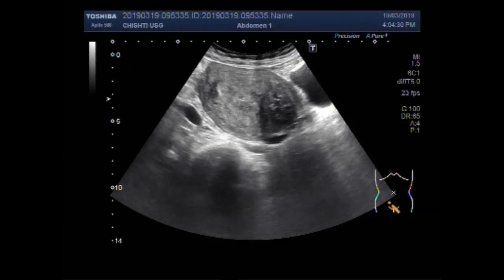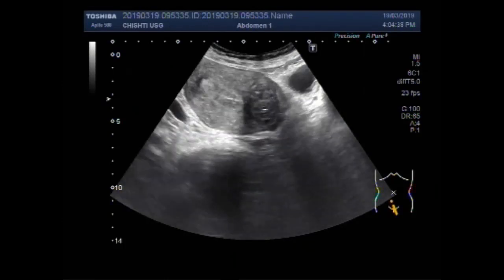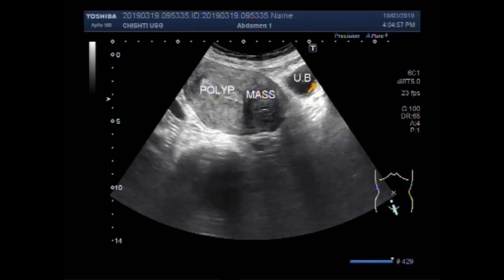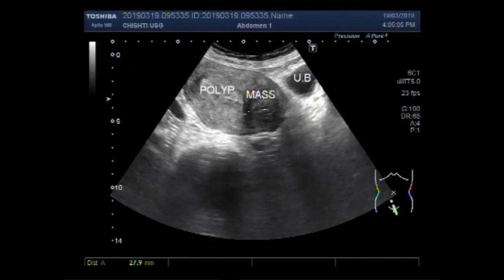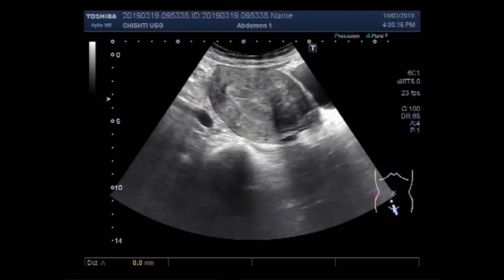Now you can see another mass in the proximal portion of the uterus near the cervix. This one is a fibroid mass and this is the polyp. The fibroid mass measures about 2.8 cm x 2.7 cm, and the polyp measures about 4.2 cm x 1.6 cm.